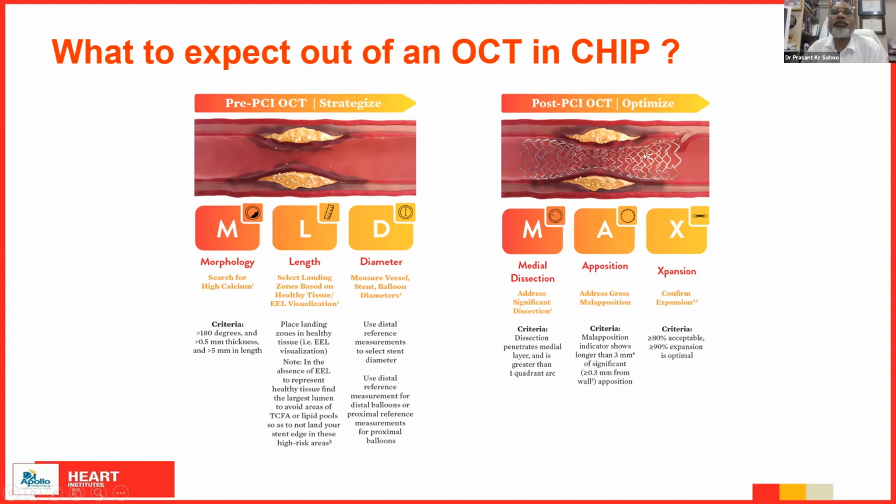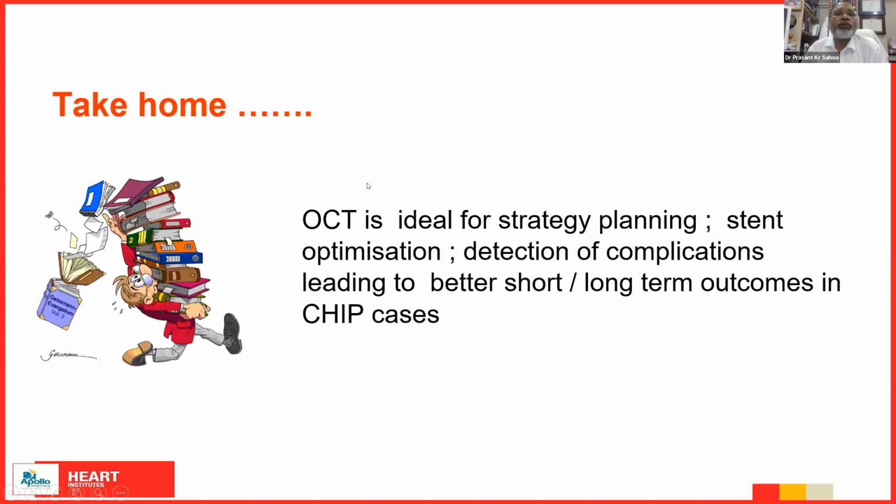And the same thing follows for a CHIP, where we have to do quick runs and finally finish up the case. So my take home is that OCT is ideal for strategy planning, stent optimization, detection of complications, leading to better short and long-term outcomes in CHIP cases.